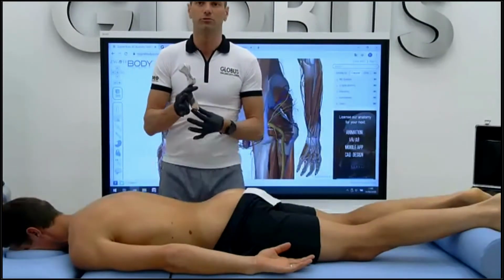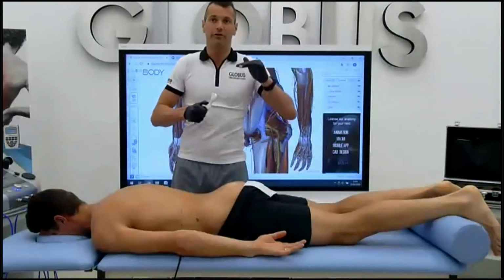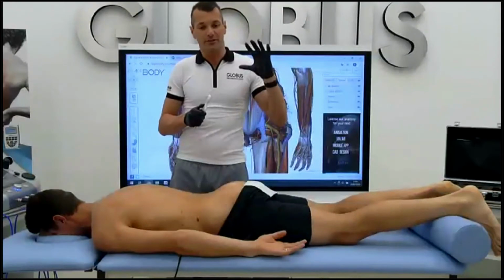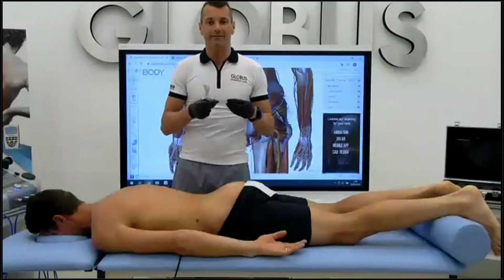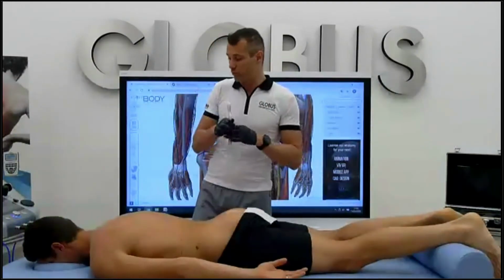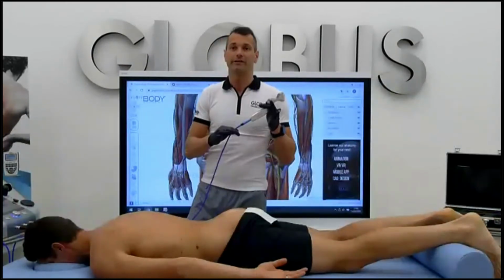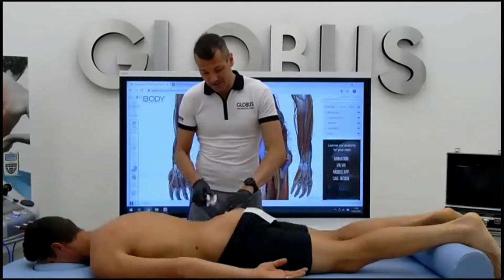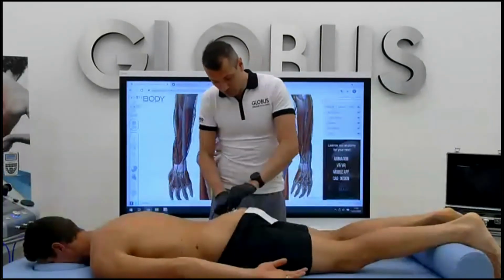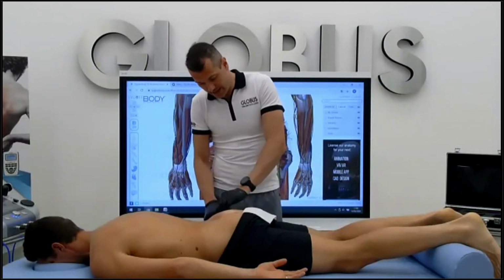When you use just the tools, you need to scrape a lot, really a lot, to increase the temperature, because as we said before, we need to reach 38-40 degrees to have this hyaluronic acid relaxation. So you don't need to do all this manual therapy, because when you connect the tool with the device, it helps us do the same thing, to increase the temperature in the hyaluronic acid layers.